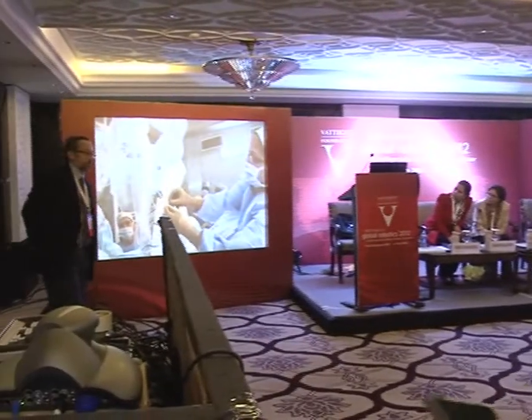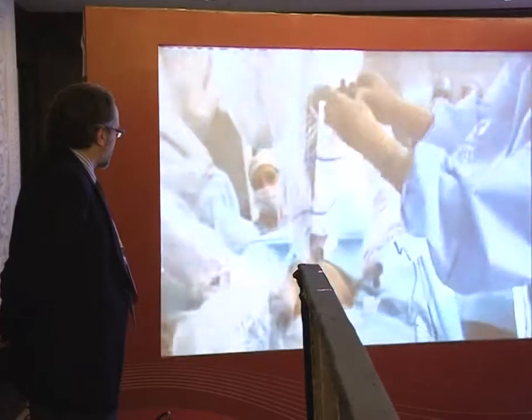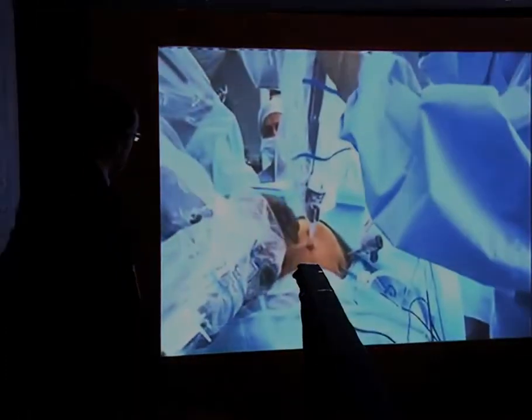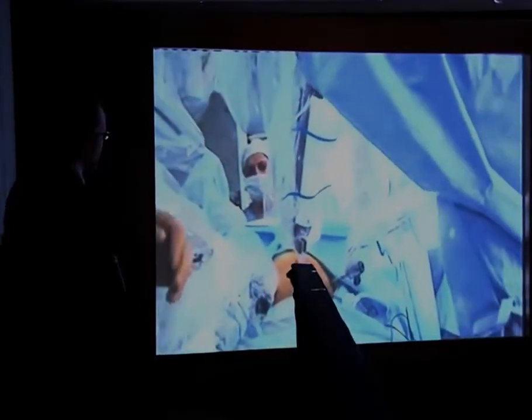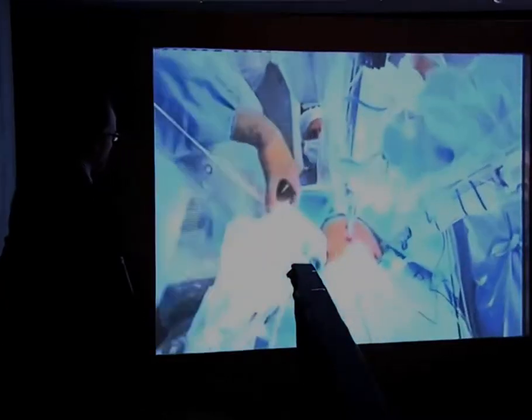All right, we'll take the camera. Just the PK plug. I'm going to do that here. And if you guys could open up that tenaculum, we'll need the tenaculum on this particular case. Robotic tenaculum, yes. I would like to have a distant look of the robot. We're going to put the tenaculum in this case in arm 3, which is in the left lower quadrant. Give me a PK. Is this a 0 degree or 30 degree? This is a 0 degree scope. I typically use a 0 degree scope almost 100% of the time, unless I'm really struggling to see something.